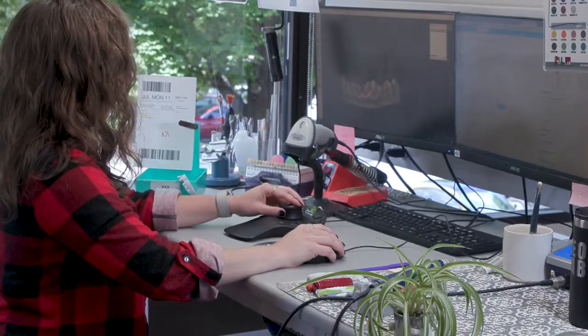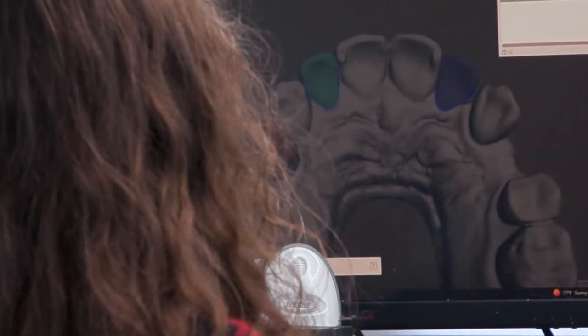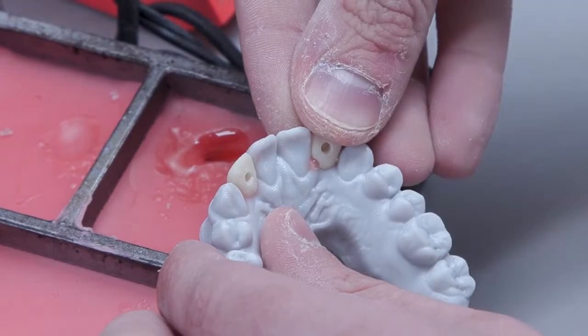After I design them, I separate it from the tooth and that's when it gets the ridge of their gum line on the bottom. So once it gets printed, it literally just clicks right into the spot.